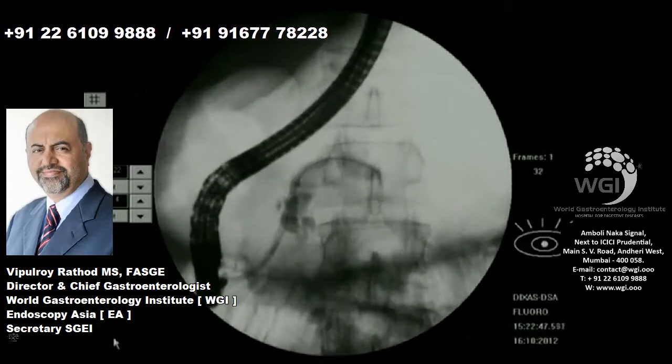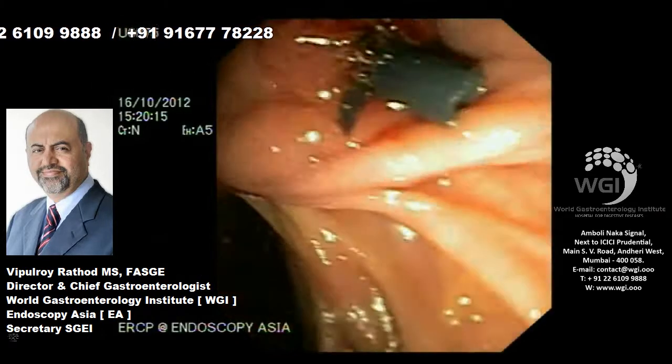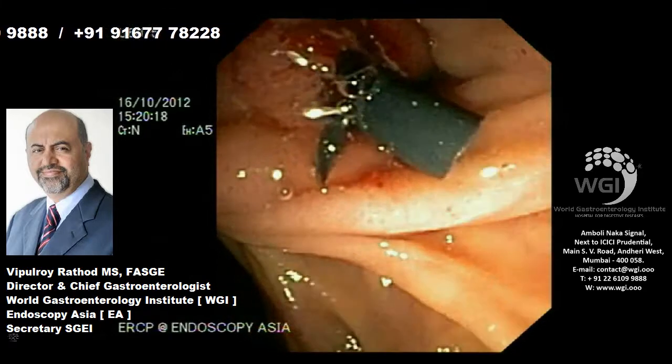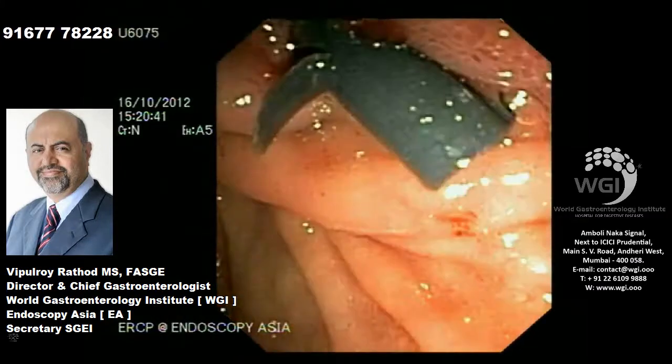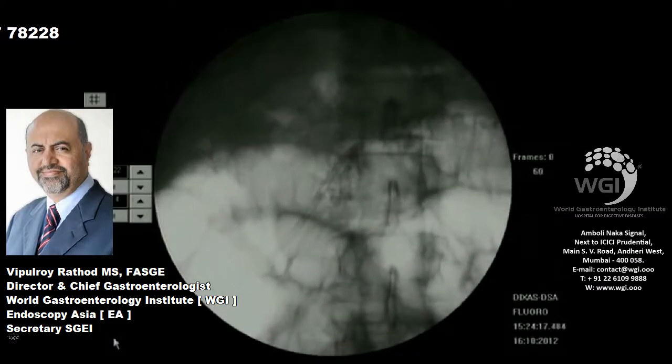So this is how EUS, ERCP and endotherapy interface will allow us to take a correct decision on the basis of EUS findings in setting of chronic pancreatitis.